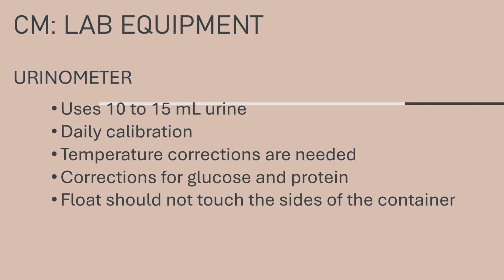Calibration is done daily, and there are also temperature corrections needed, for samples with temperature differences greater than 3 degrees Celsius from the calibrated temperature.